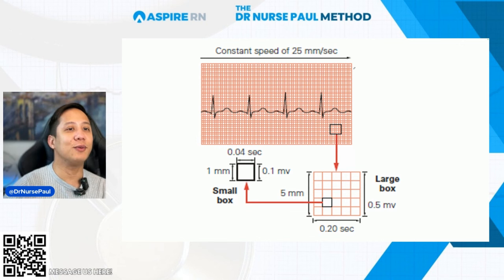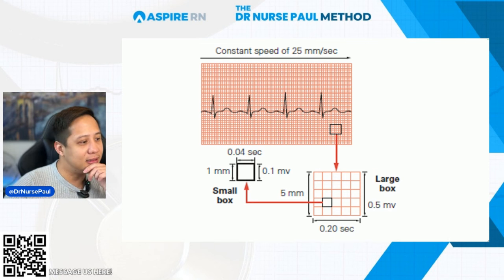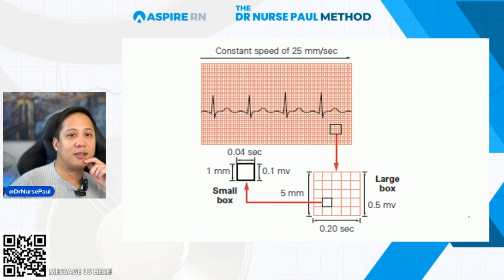Who gets intimidated with an EKG strip here? Be honest. I love EKG strips, all right? When I was in the ER, and even now in my practice in urgent care, I do a lot of EKGs. I just did an EKG for a lady last night, and I figured she was having right bundle branch block that she was never diagnosed with. So I put in a referral for cardiology to perform more tests. But yep, who gets intimidated with EKG?